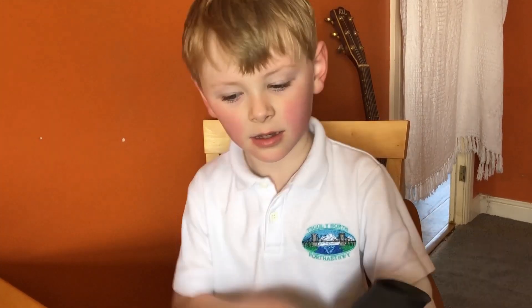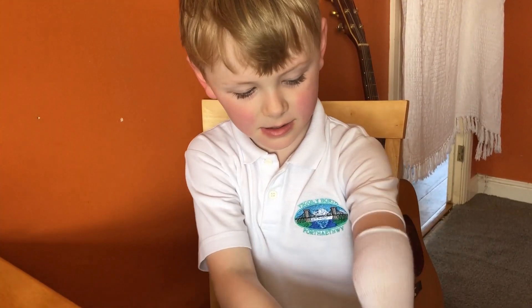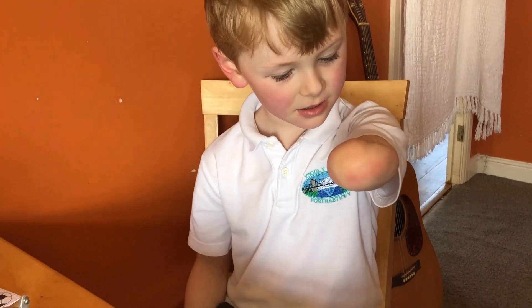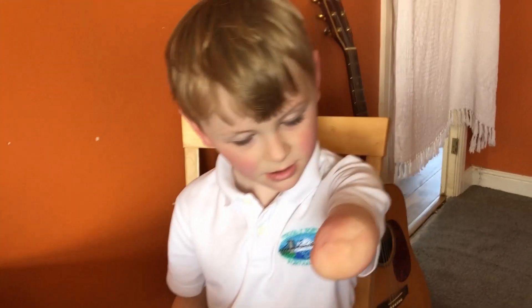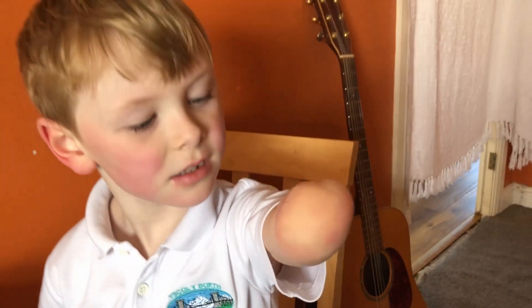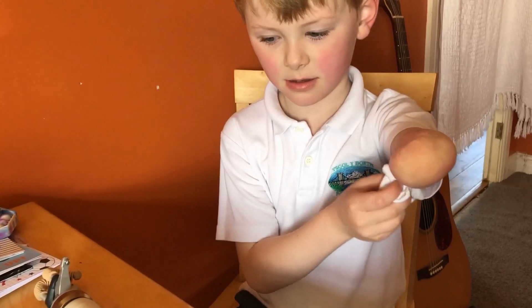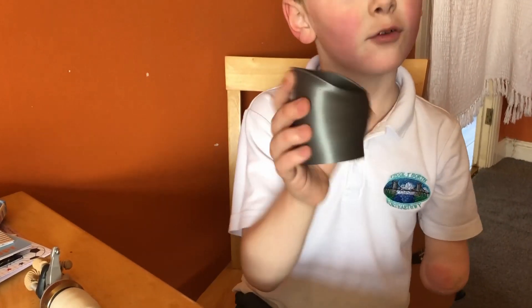Sol shows the red mark — a little bit red there. We take test socket 4, put it on, and check how it fits.